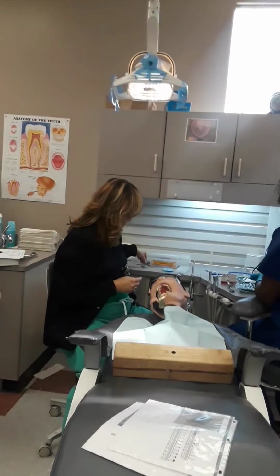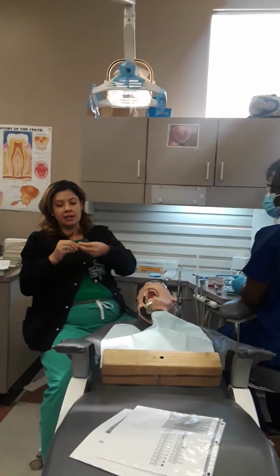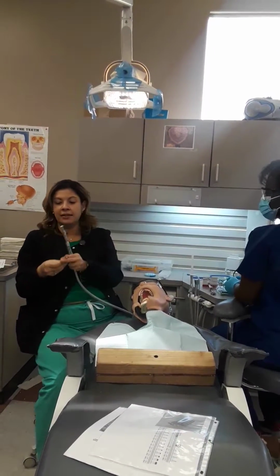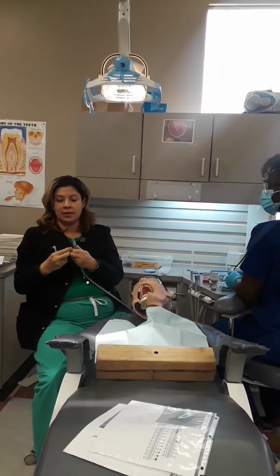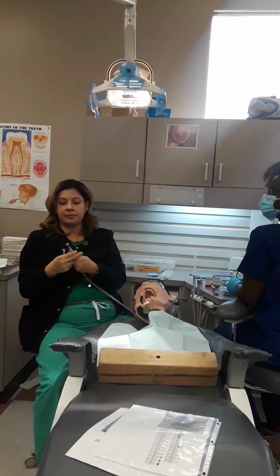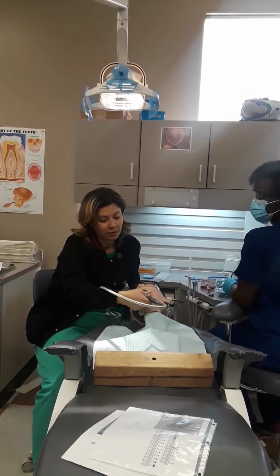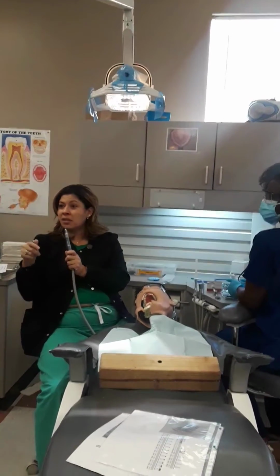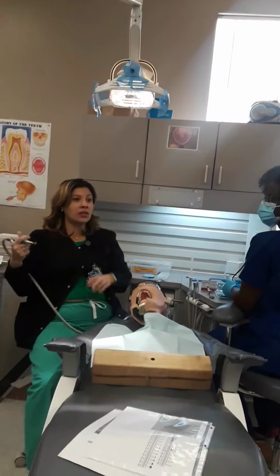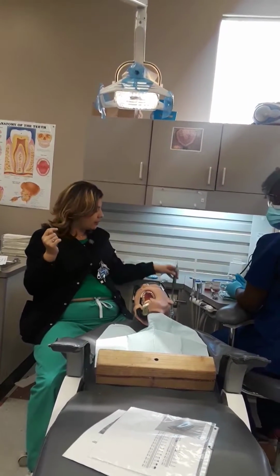Polishing disc. Okay, this is it. I just got a big one so you can see. This one actually goes into my straight handpiece, so we would have to take my contra angle off, and then it'll go into my straight. Now, if I use a disc, these are only for facial and lingual surfaces, okay? So that's how you can tell. Any other of the burrs, you can use in any other position or surface, just depending on what we're doing. Like a flame would be class 5, so I can get underneath that gingival tissue so it doesn't hurt. Okay.